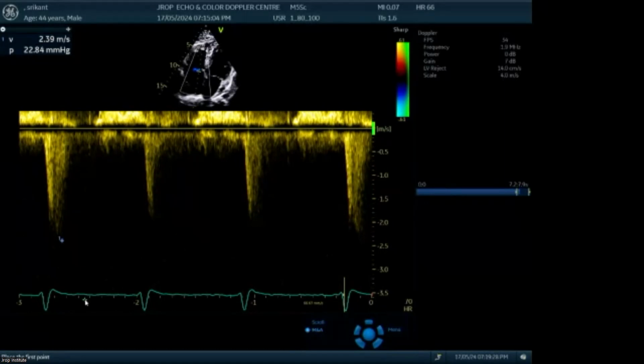In practical circumstances, we are not using peak pulmonary artery pressure. We are using mean pulmonary artery pressure. So whatever the peak pulmonary artery pressure is, we multiply by 0.6, and then we add a constant of 2.1. 30 multiplied by 0.6 would be 18, add 2.1 would be 20.1 millimeters of mercury. Anything less than 25 millimeters of mercury, the guideline says up to 20 is definitely normal. 20 to 25, we have to look at this subject in follow-ups. More than 25 is definitely pulmonary artery hypertension.